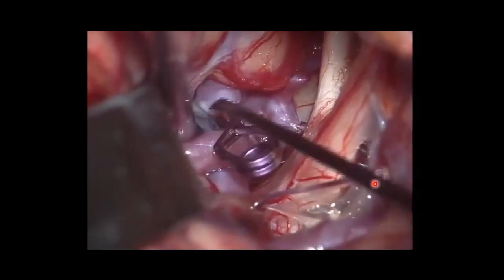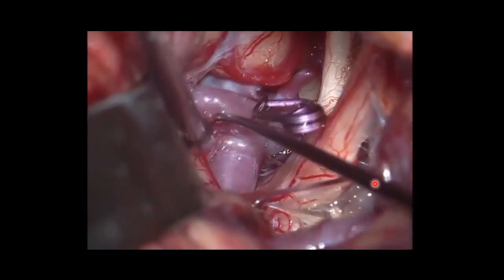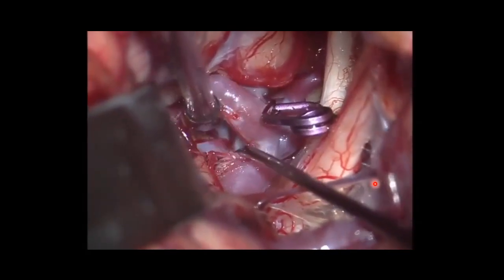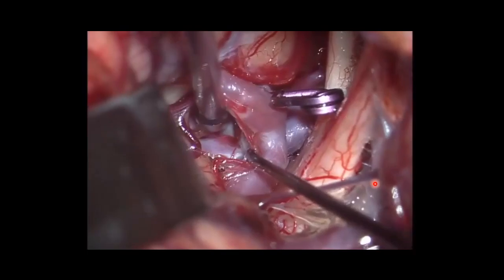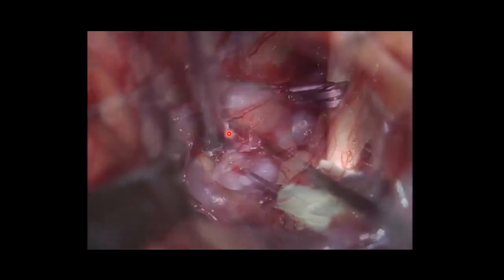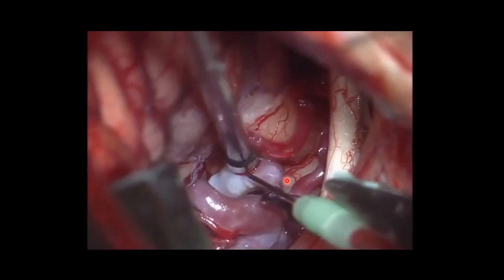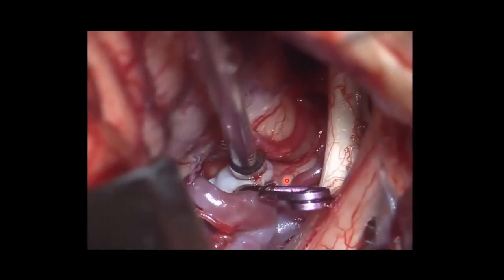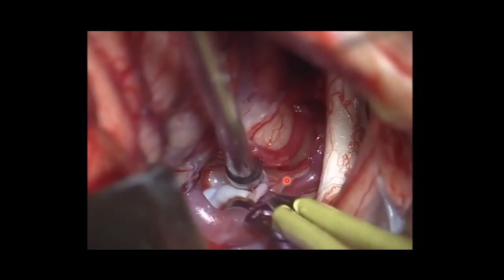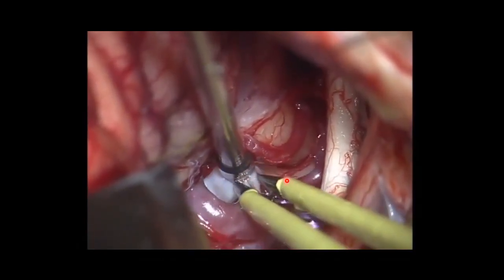Okay, that's A2. So still neck left over there, here. Still neck over here. It's puncturing. He thought that the aneurysm had been completely occluded, but it's not, so it's still bleeding.